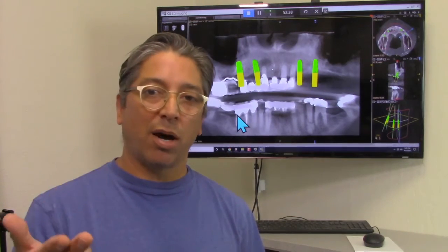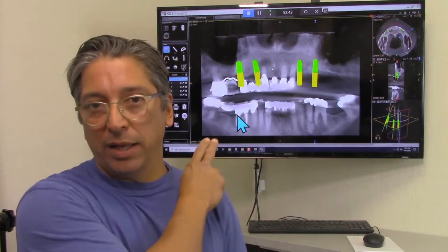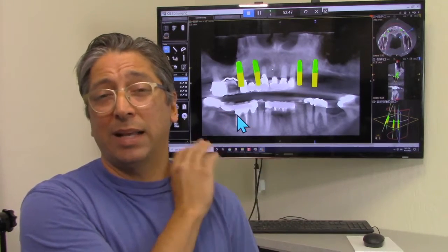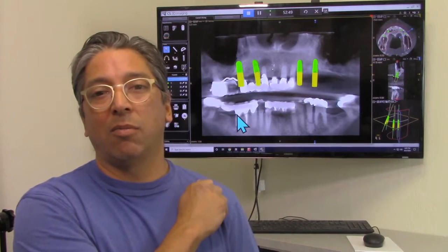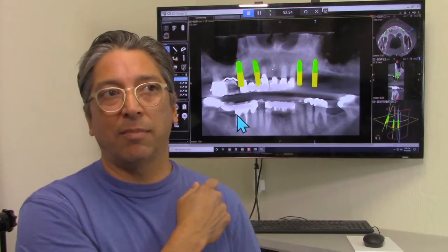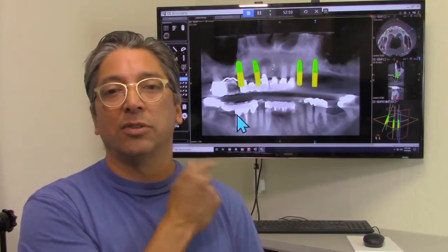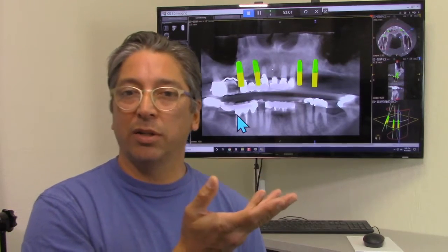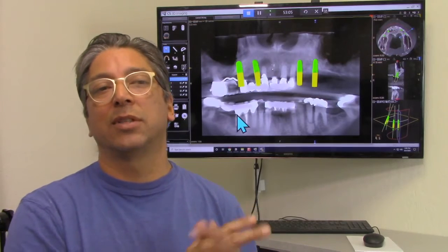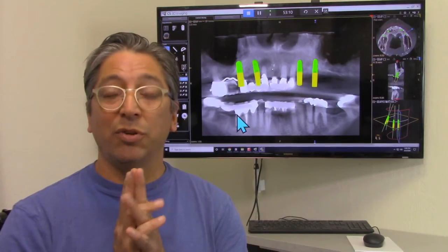We'll talk about products. We can talk about full arch rehabilitation treatment planning cases like this. We will follow some cases that you will see how the treatment ends up. Not everything comes out perfectly sometimes. Sometimes things require more attention later on as well. We'll talk about those things. Those are the things that are very important when you're starting to invest and look into full mouth rehabilitation type treatment plans.